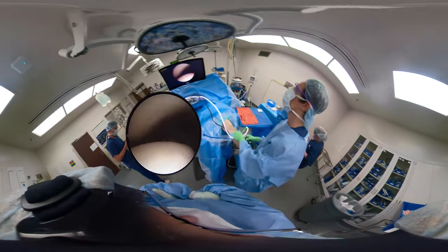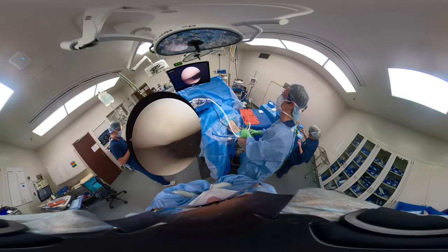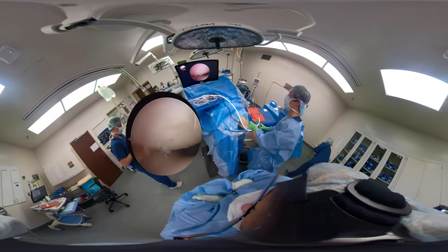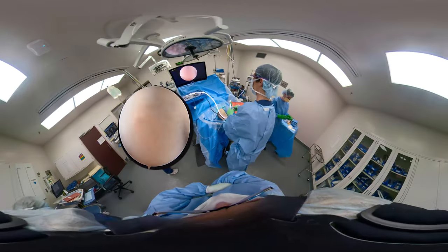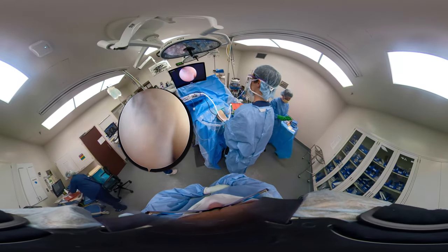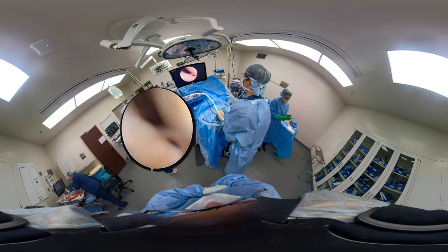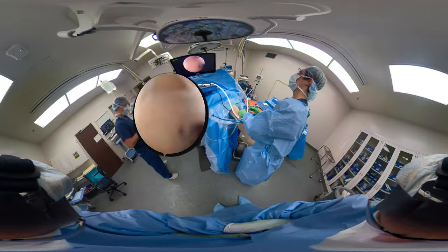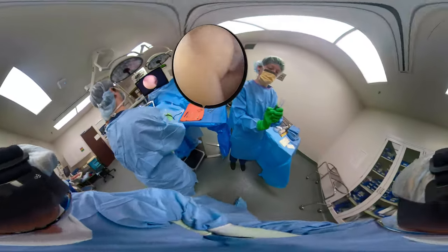Looking at the patella, tracking of the patella — flex and extend the knee. We'll stop to take pictures on occasion. If he changes his hand to be underhand and puts his hand closer to the light cord, he can move the light cord around accordingly and free up his other hand to triangulate and do the work through the medial portal.